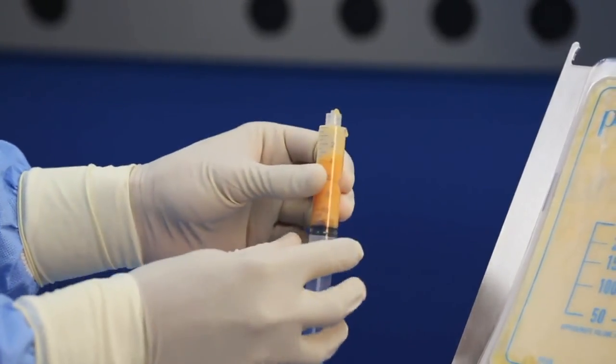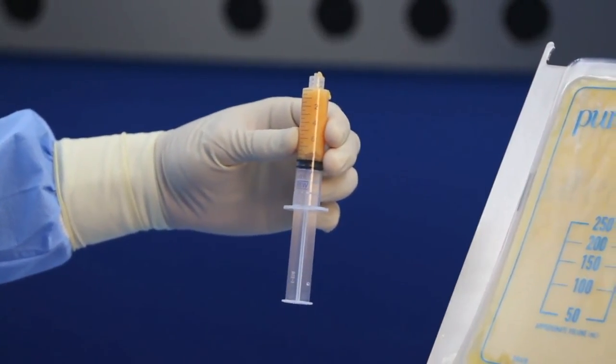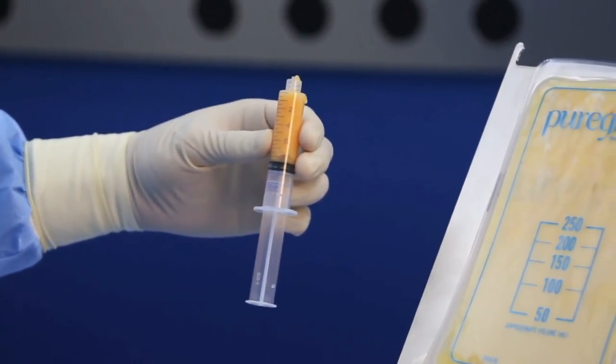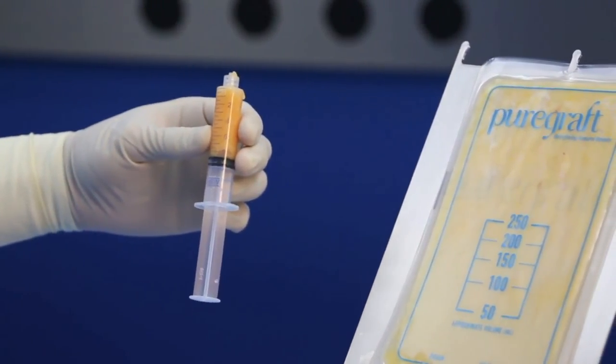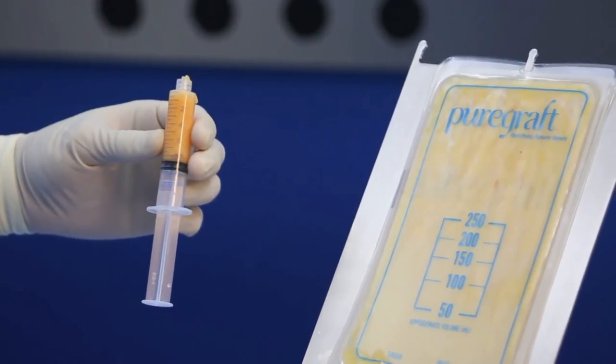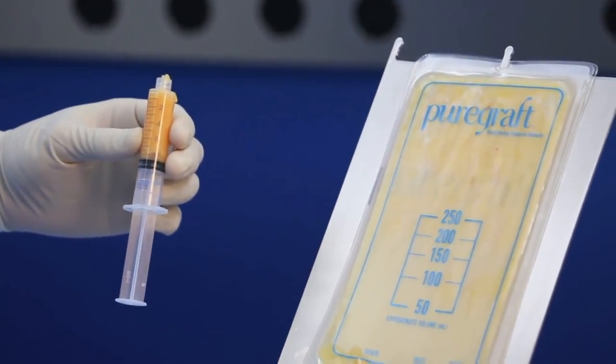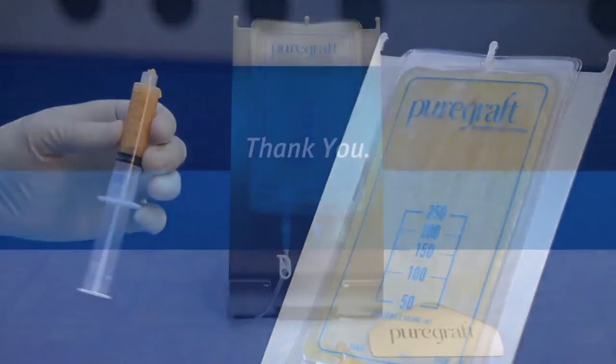As expected, you will notice that the final graft volume is approximately half that of the starting volume. This volume change comes from the ability of PureGraft to remove excess fluid, free lipids, blood cells, non-viable tissue fragments and debris, retaining healthy, viable adipose tissue within a closed system and providing a purified graft to deliver to the patient.